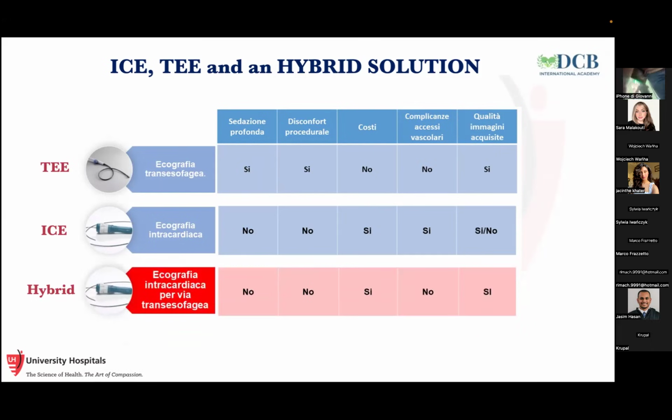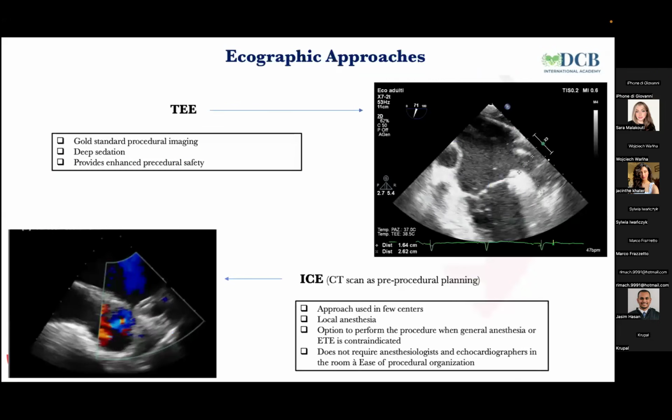There is a new approach, just published in JACC Intervention, where a group from Italy used intracardiac echo, but through a transesophageal route. This is a new approach, a hybrid solution we can say. As we can see, I show you the images from two different approaches.